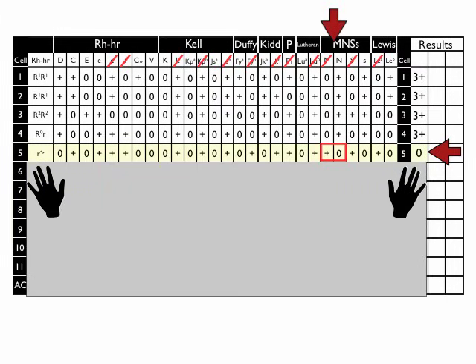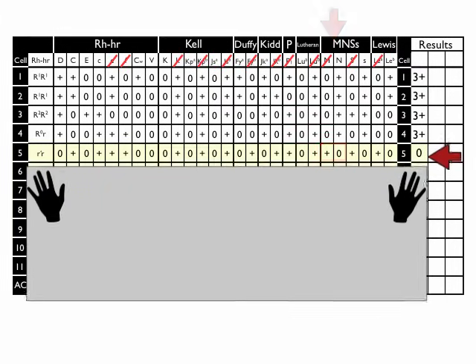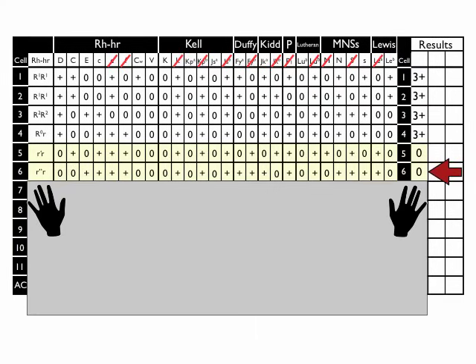Okay, so you've finished with cell 5. Now we want to move on and look at the next negative one, which is cell 6. And guess what we do? We do the exact same thing. Okay, look in cell 6. We go pair by pair. We've got Lewis A, Lewis B. Again, this is a double dose Lewis A. You put a single slash through the Lewis A.